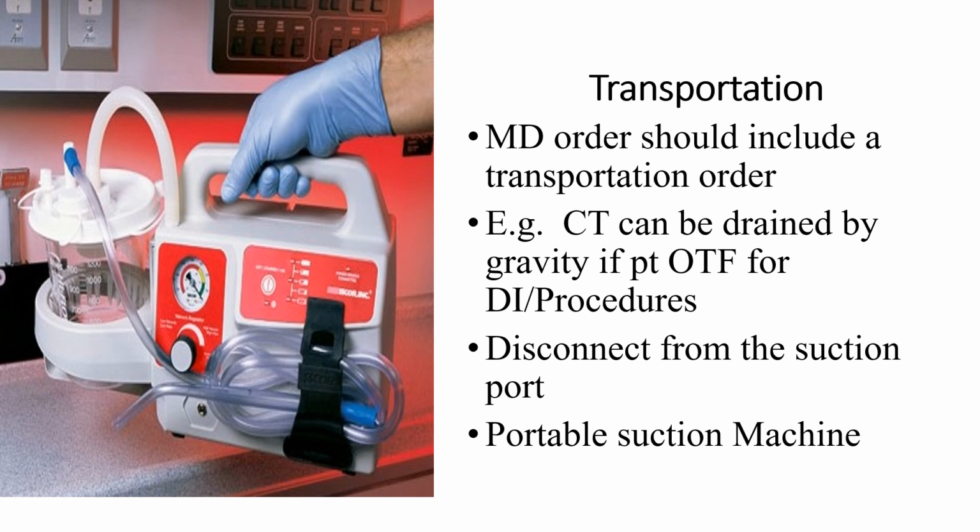Ensure that the tubing is not kinked or bent onto the patient or in the bed rails or compressed by the bed. You'll also ensure that even during transportation, that the collection chamber or drainage system is always below the level of the chest and secured to prevent it from being accidentally disconnected or knocked over.